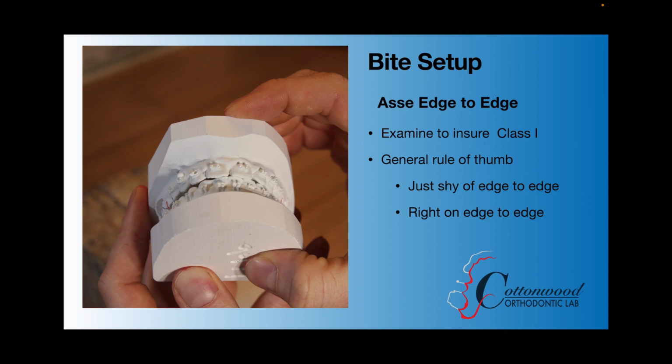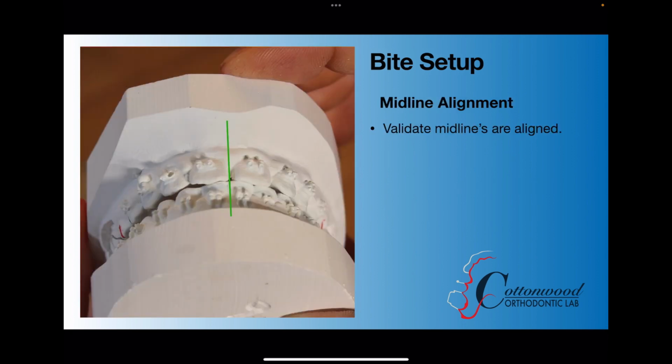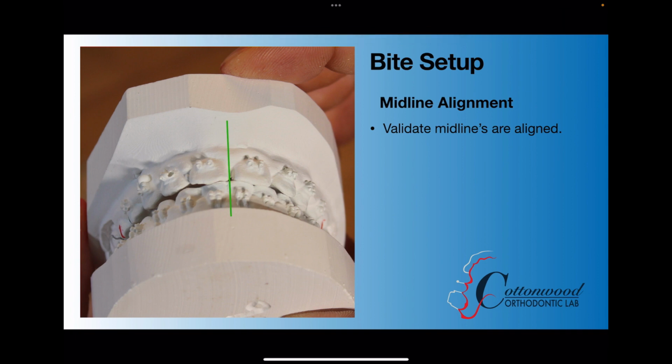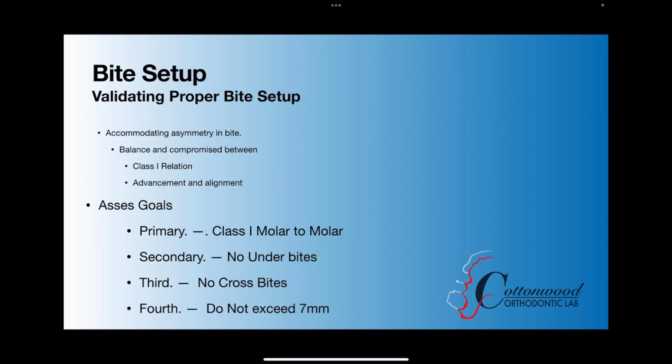You want to see how your edge-to-edge relationship is going on. You either want those anteriors just shy from edge-to-edge or right on to edge-to-edge. This might change with an anterior open bite or any kind of asymmetry that you run into with your models. It's important to make sure that the midlines are completely aligned. Very important.